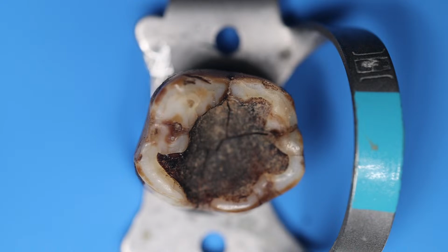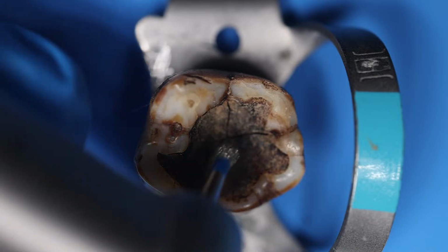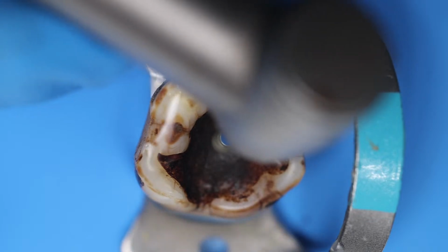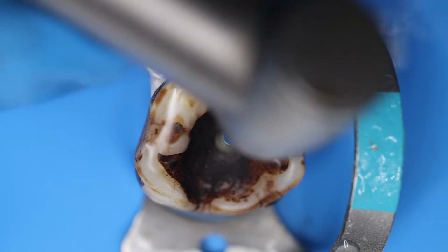So let us begin first. See, when we are using the round burr, just begin from the center. Remove the caries, then we are just into the canal. As you can see, we are just progressing into the center.